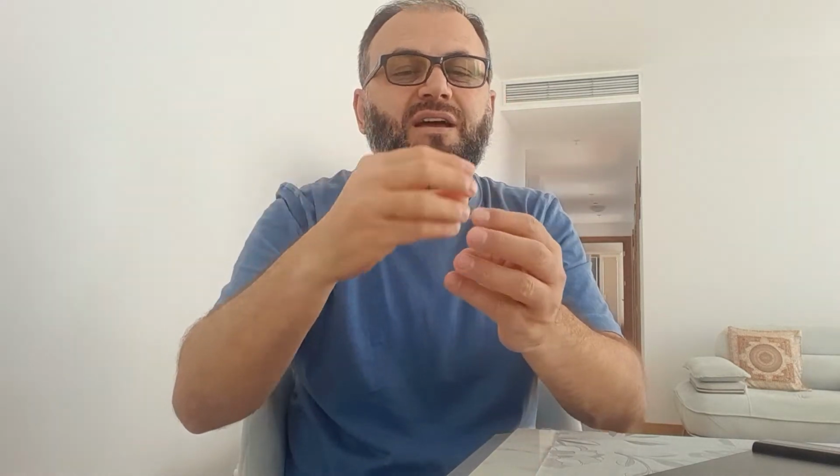So the next pulse is not emitted or fired until they get the information from the first pulse. So sometimes what happens is a violation, where a premature pulse comes. The second pulse comes before the first one takes the information to the point. So they meet in the middle way, and then they just receive this information. So the second pulse takes the information from the middle, from the halfway, and takes it to the processor. And they tell them that I got the information from here. And they represent the information from the wrong location.